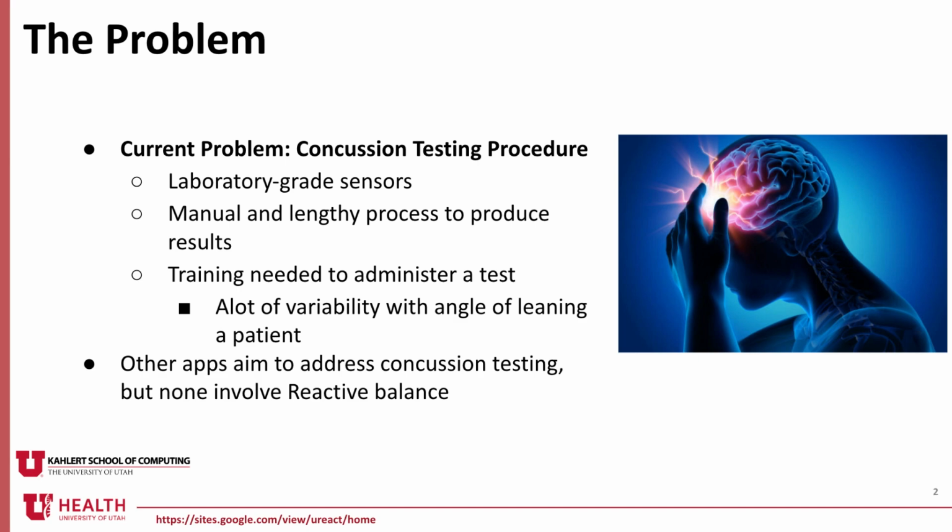They use 6 laboratory-grade sensors to accumulate data during a test, but most clinicians and athletic trainers do not have access to these. Their process for collecting data and viewing results was not very streamlined. It involved first attaching 6 sensors to a patient, then administering a test, exporting that data collected from the sensors to a computer, then running that data through a MATLAB script which would eventually output understandable results.